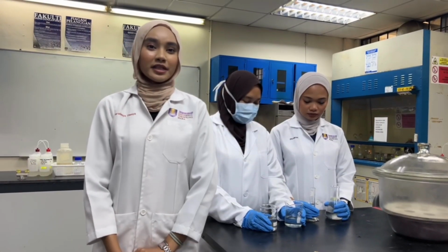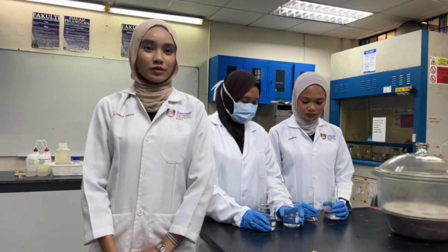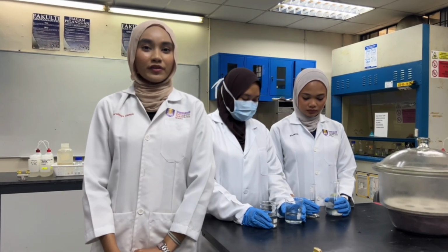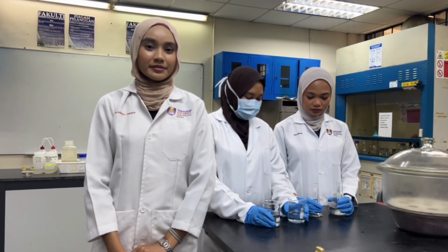In this scenario, a laboratory student is handling a volatile solvent. The fume hood is not being used and ventilation is poor, allowing chemical vapors to accumulate in the work area.